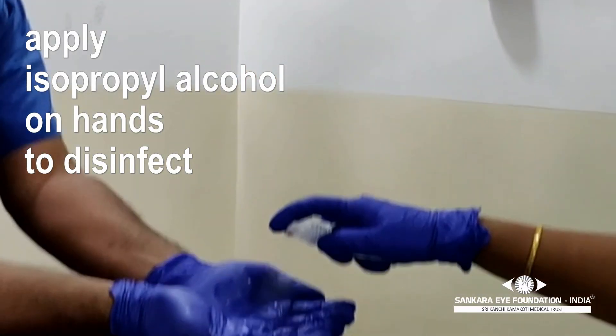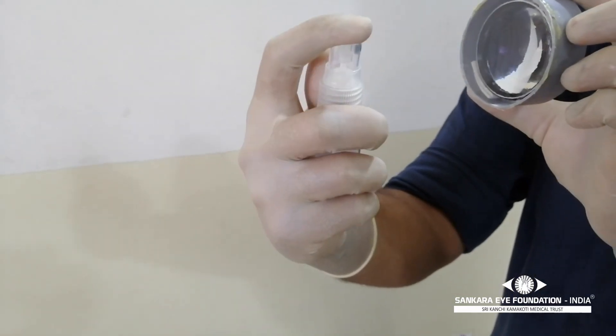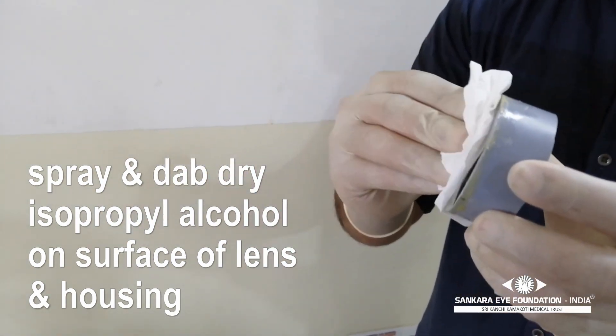Before removing the indirect ophthalmoscope, clean your hands with 99.9% isopropyl alcohol. The lens covering can also be cleaned using the same spray and a clean tissue paper.